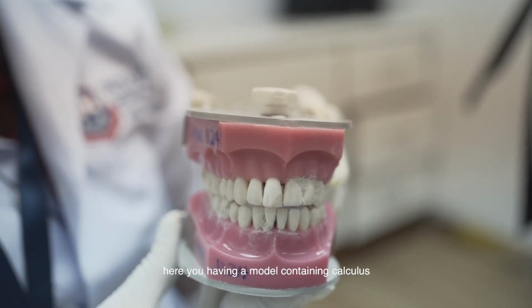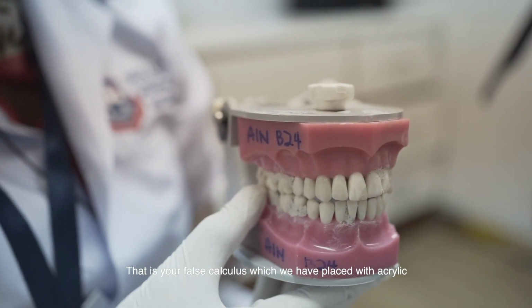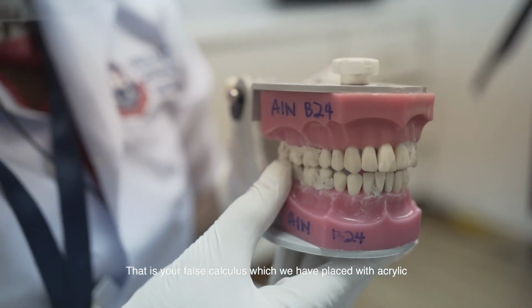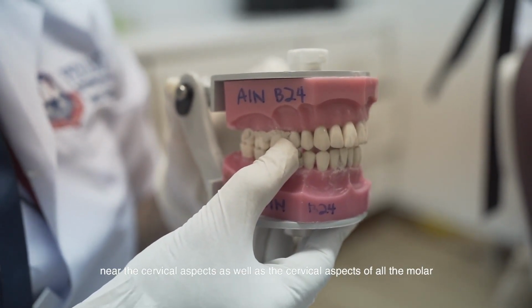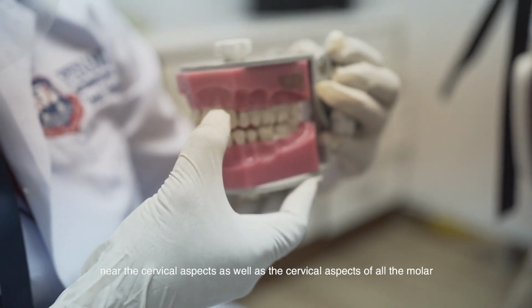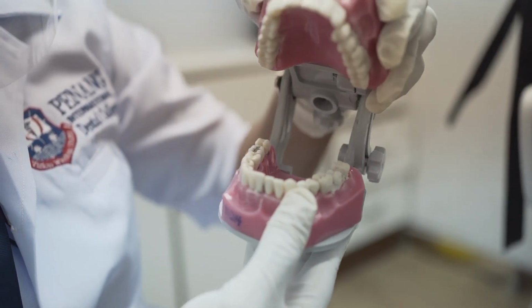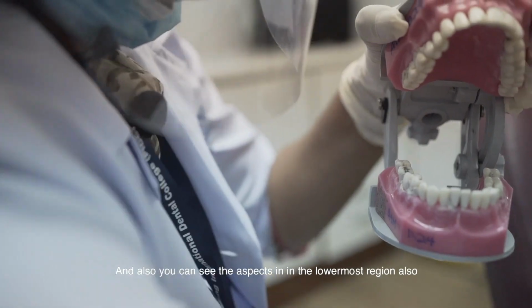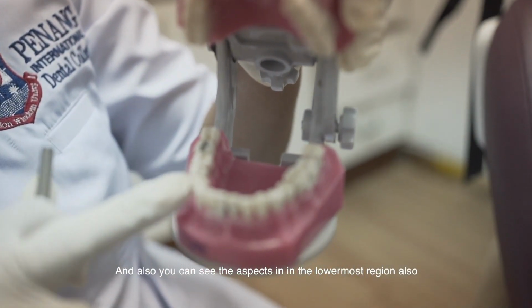Here you have a model containing calculus, that is your false calculus, which we have placed with the acrylic. So you can see that the calculus is attached on the tooth surfaces near the cervical aspects of all the incisor as well as molar teeth, and also you can see the aspects in the lowermost region also.